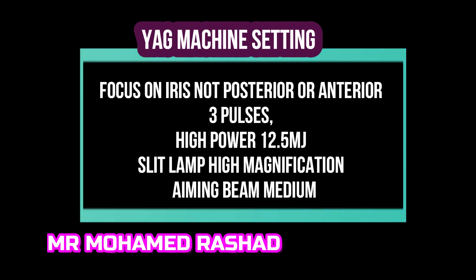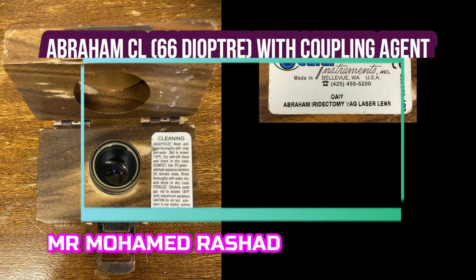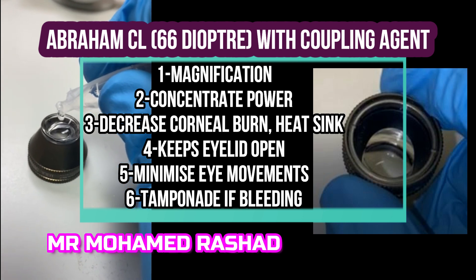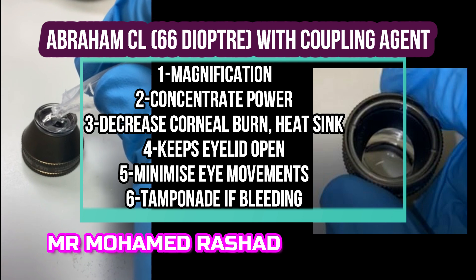The settings are high power, three pulses, high magnification, and medium aiming beam so the focus is on the iris, set at zero. The Abraham contact lens helps with magnification, concentrates the power, decreases corneal burn, keeps the eyelid open, minimizes eye movements, and provides tamponade if there is bleeding.